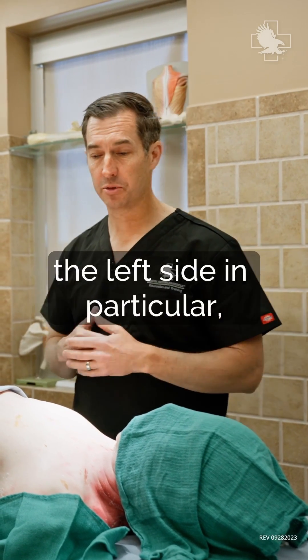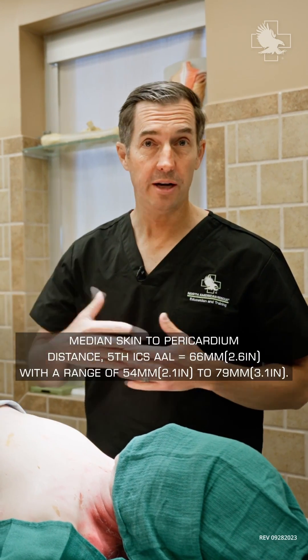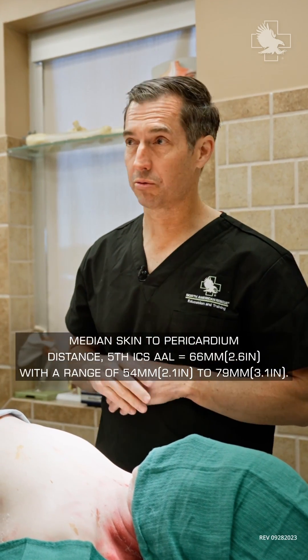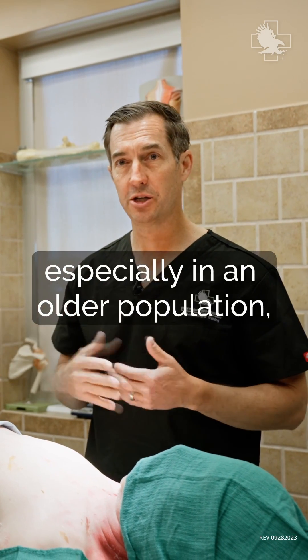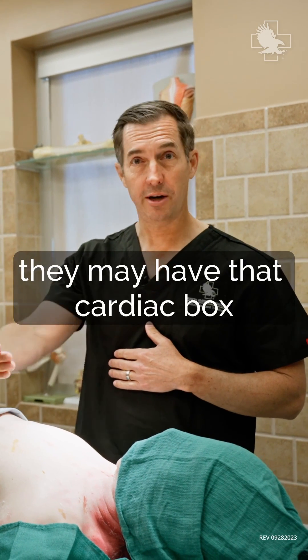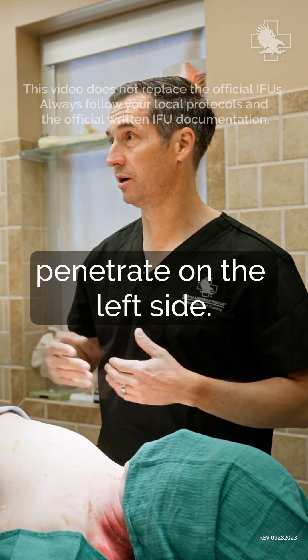One of the issues on the left side in particular is that the heart lays over on that side, and it varies by person — not everybody's the same. Some people, especially in an older population or those with comorbidities, may have the cardiac box right off the left side, within two to three inches. So we don't want to over-penetrate on the left side.